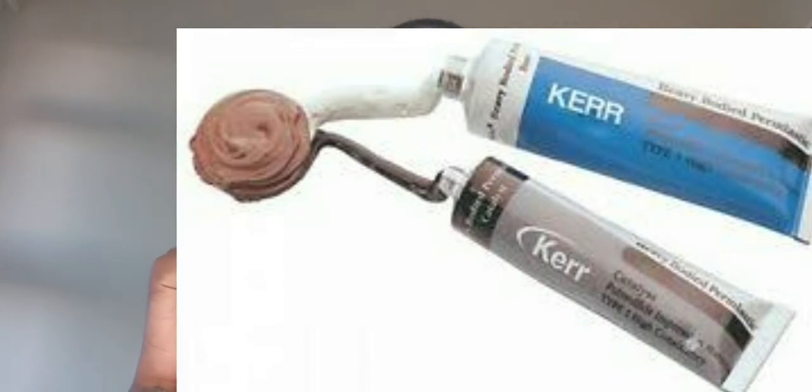So it's the larger white tube, whereas the catalyst is the smaller reddish tube.